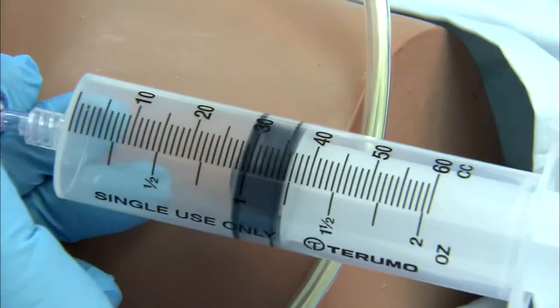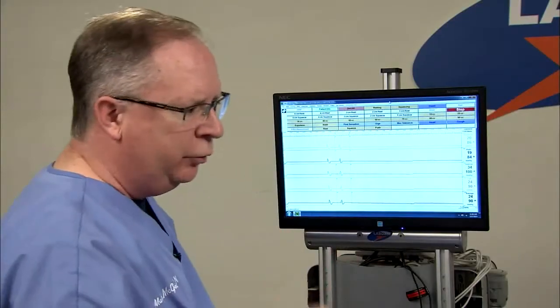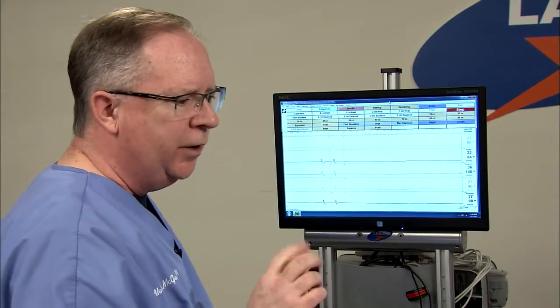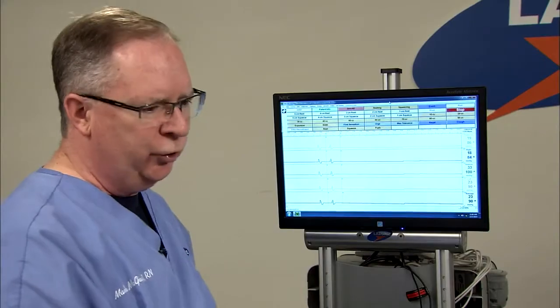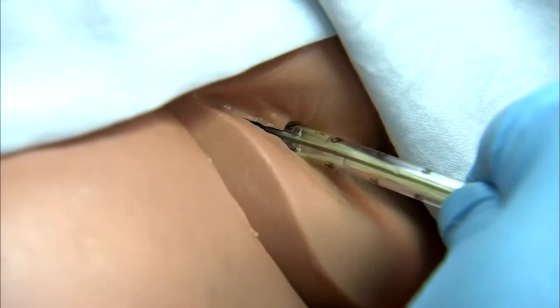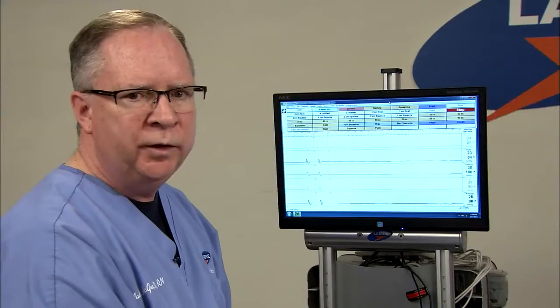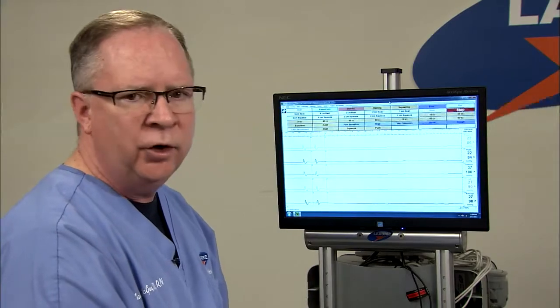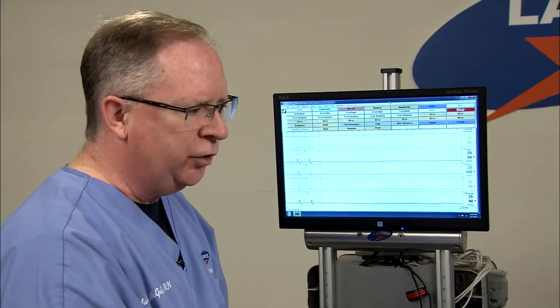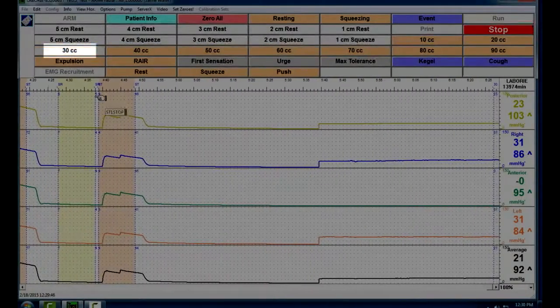With 30cc of air in the syringe, it's really critically important that you maintain the position of the catheter. We want to make sure that the catheter is at the high pressure zone. If it was two centimeters, we want to make sure that the 2 centimeter mark is at the anal verge. It will take 2 people at this point because one person must hold the catheter to keep it from migrating. The other person is going to be managing the syringe. Click the 30cc RAIR button on the control panel.